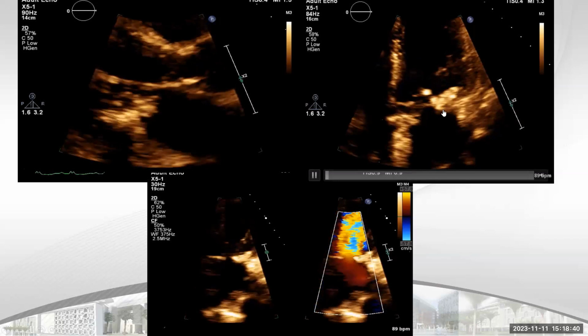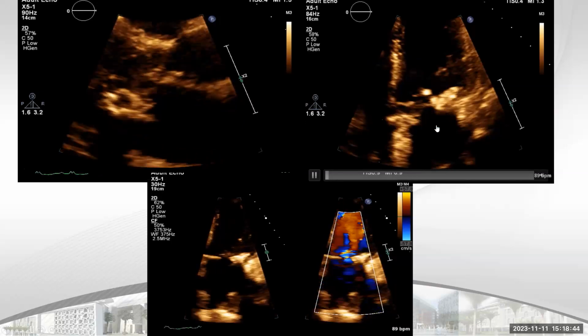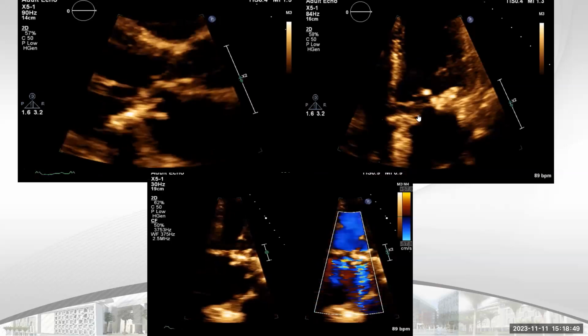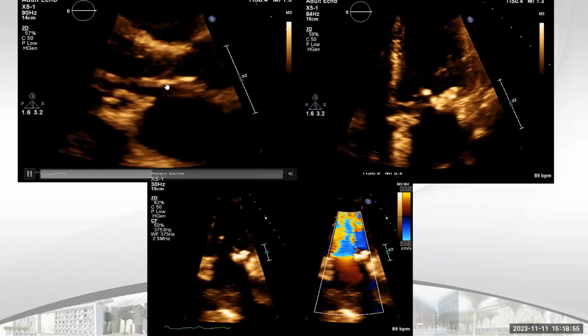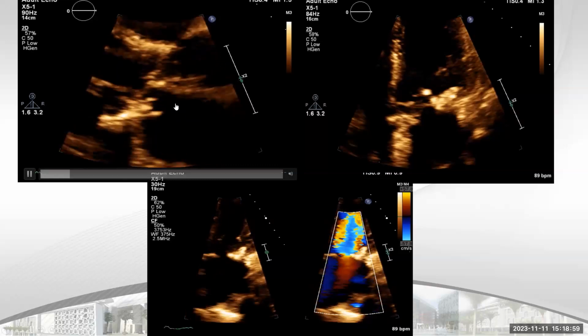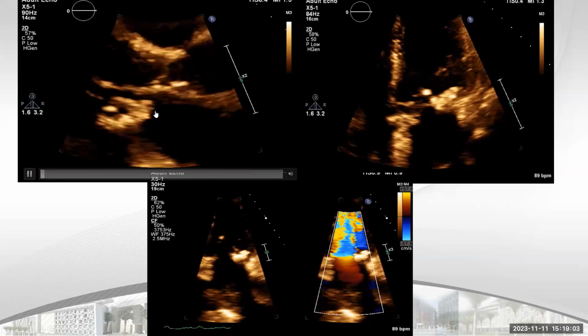But if you have normal flow and you have anything after that, we don't call this fistula, we call this just perforation or a leak. Usually in case of pseudoaneurysm of the intervalvular fibrosa, it may fistulate, but usually between the LVOT and the left atrium, or the aorta and the left atrium as well.